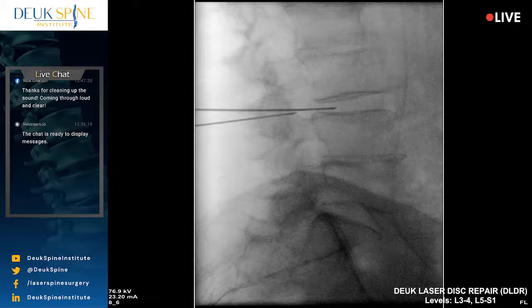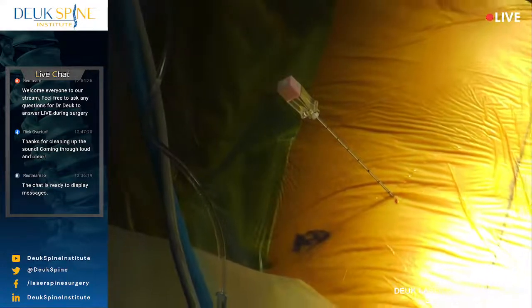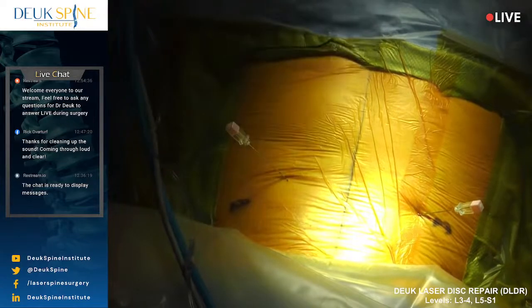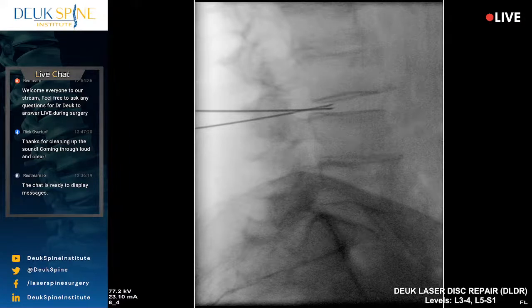I'm very happy with that. All right, you can actually see the herniation. Can you see it? Jordan, can you show it to them? There's barely a faint outline. That's correct, a little curve there. It's like a half of a peach or something just sticking back there. So you really can see certain herniations on X-ray. And of course the size of the herniation, location, and then of course the amount of bone mineralization the patient has is important. All right, so basically if you have really fainter bones, it's easier to see.